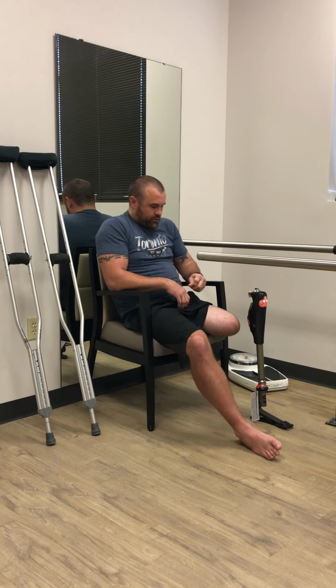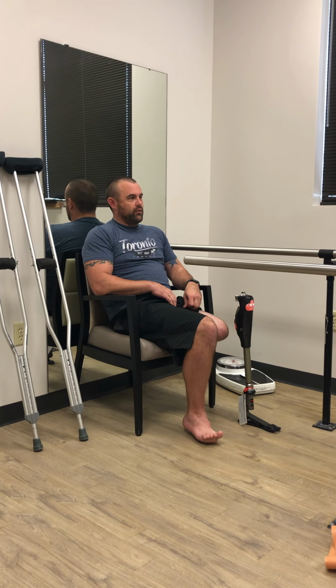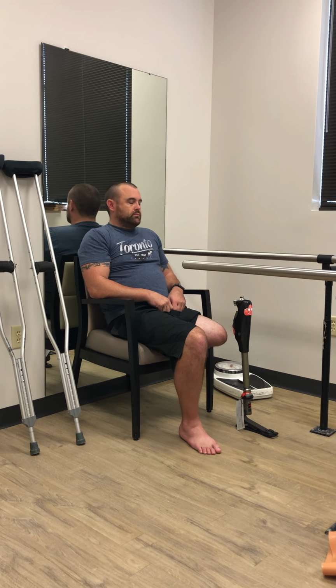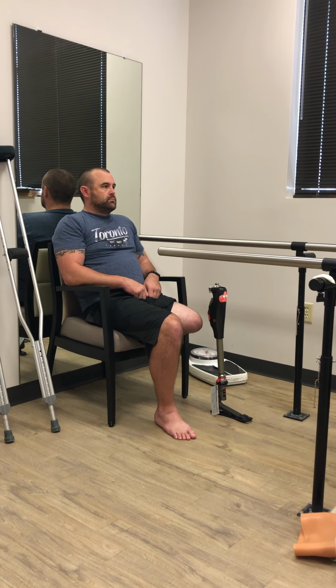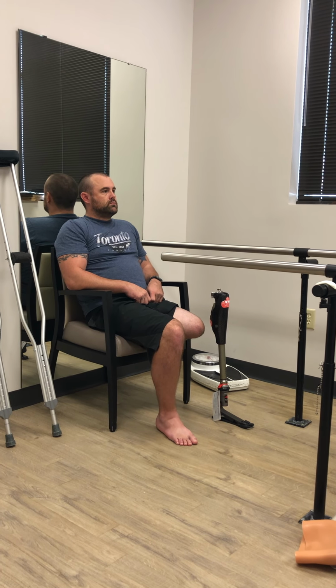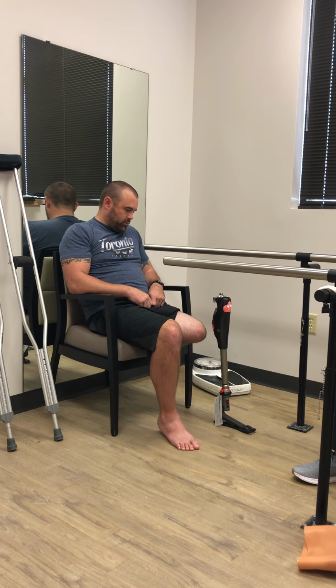Like I said, I see it more and more, I'm very much seeing your ankle angles starting to go inside of my foot. Yeah, compensating, and you've got pretty big calves and pretty small ankles, so it may become a problem sooner rather than later. So I would definitely recommend going down that path now for sure. Yeah, we'll make that happen, no problem. Yeah, I would like to.